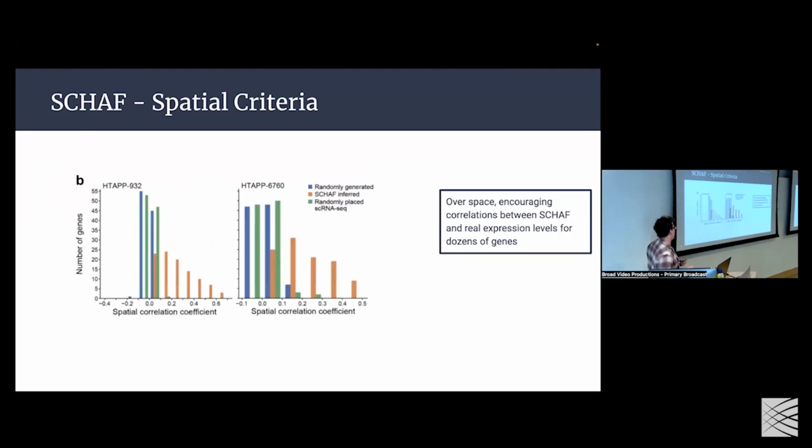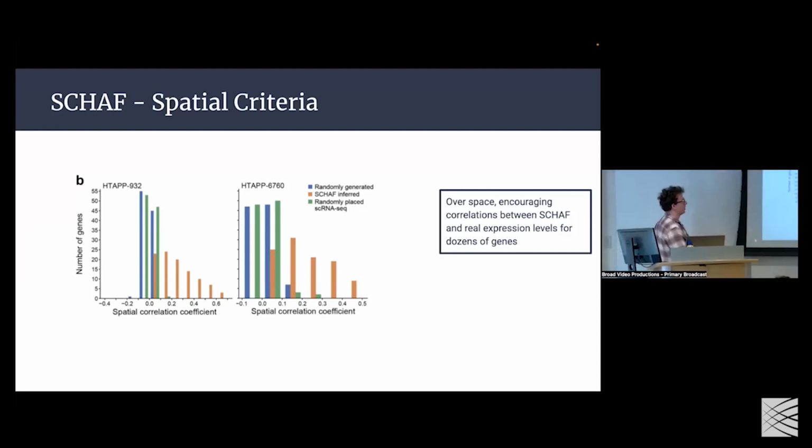If we then look at all the genes that MERFISH informs us about, it's on the order of a couple hundred. Then we can see how many genes have this strong of a correlation. Before, I showed 6 that had a particularly strong correlation. What you see here is scores of genes that are over 0.3, 0.4 correlation, which I know sounds not very strong. But if you look at what else is going on in the field, that is comparatively very nice. So we're very satisfied to see this.